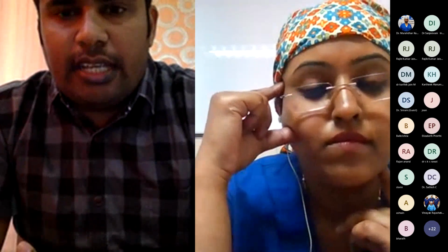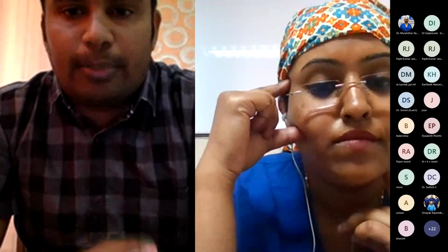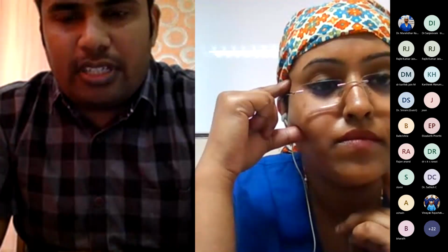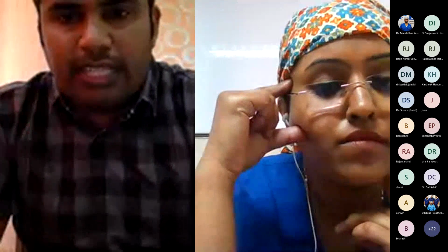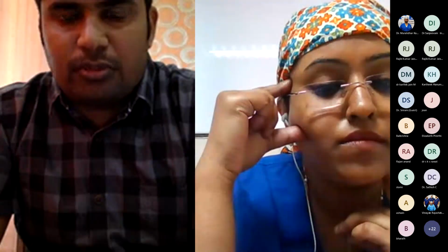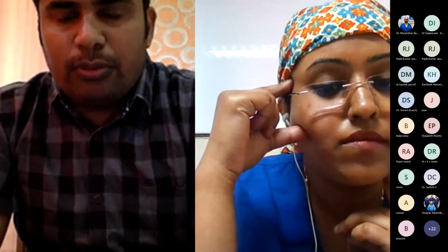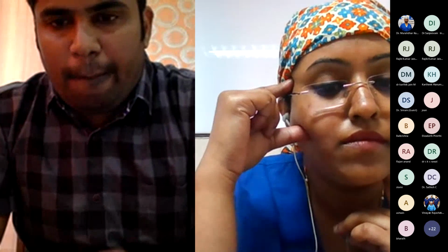So here the LA can be seen similar to the transthoracic apical 4-chamber view. This view is described, but many times I couldn't get it. I tried multiple times. It's quite invasive. If we try it multiple times, it can injure the stomach also. So care should be taken. If at all we have to do it, it has to be done once or twice only.